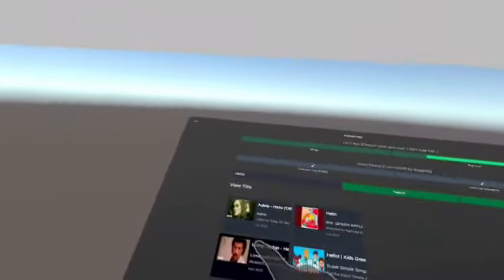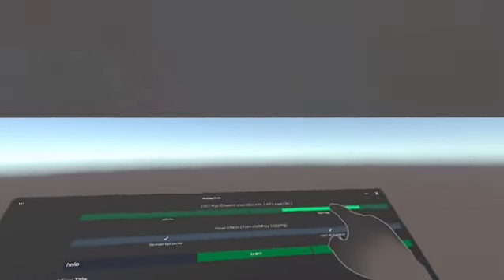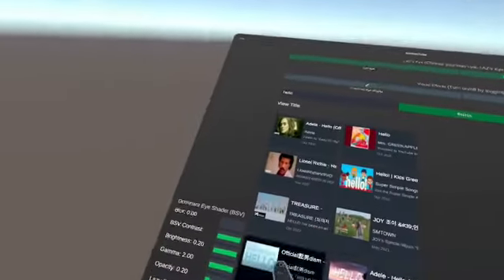Now you can see, you can play these YouTube videos here, and you can make them opaque. In this, what I am doing is adding some opacity. Let me just show. See, this is how I am doing it. On the screen you are just seeing the left eye. If my right eye is a lazy eye, and you are seeing the left eye only, so the left eye is the dominant eye, now you can give the shading effects. You can see that there are some shading effects here. You can change the shading.